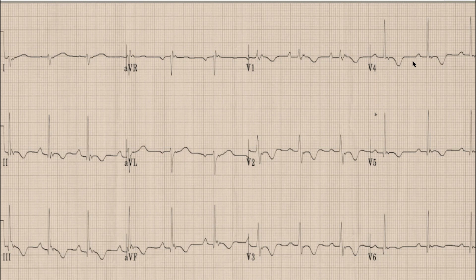As you know, the first thing we look at on an ECG is rhythm. For rhythm we will look at lead 2. As we can see, there are upright and prominent P waves before each QRS complex. Whenever you find an upright and prominent P wave before a QRS complex in lead 2, it means that the rhythm is sinus.